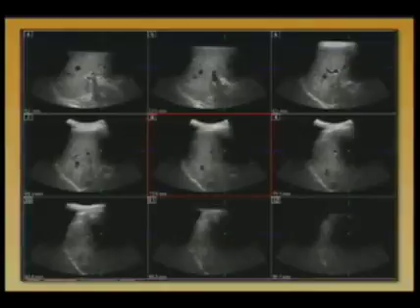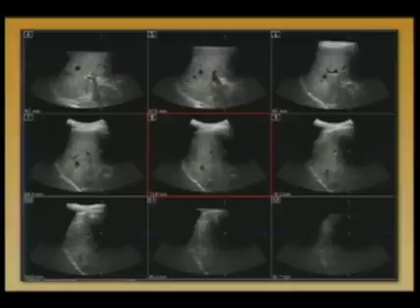The other question that arises is when you use the paradigm that takes the patient, does the 3D volumes, and then you send the patient away and then do the slicing of the volume post hoc, the question is, will you be able to see every abnormality that you would have seen with this traditional technique of ultrasound imaging?